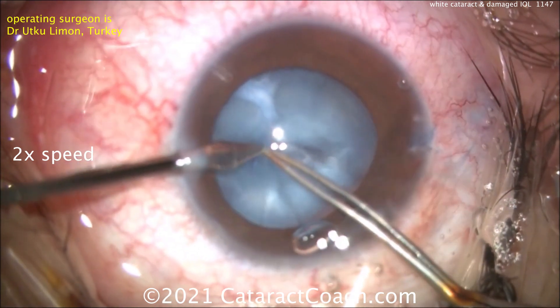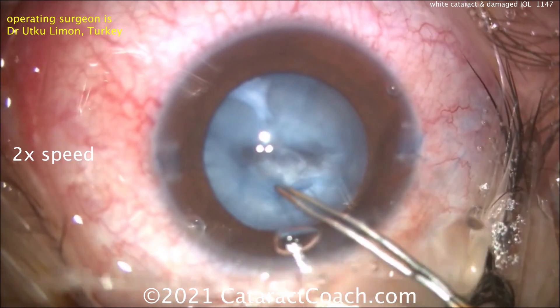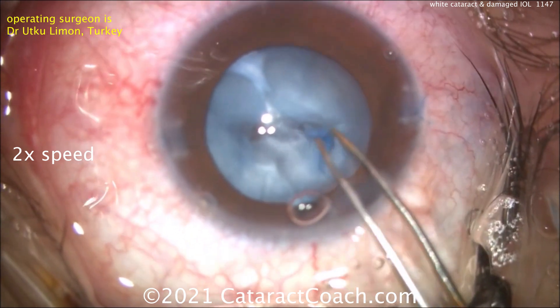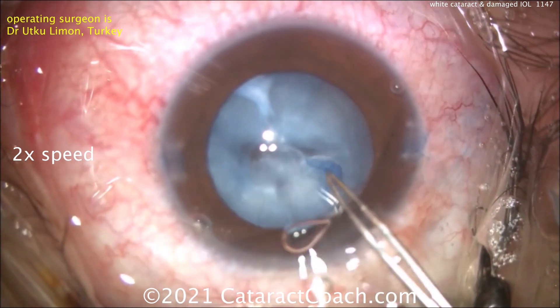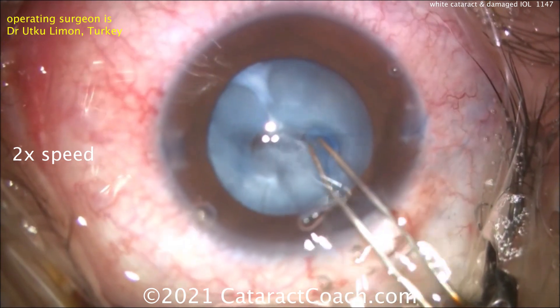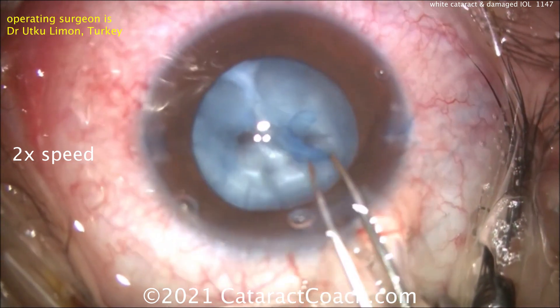Here's something innovative — using an MVR-style blade from the paracentesis to help nick and cut that capsule to continue and get the rhexis going. And here we go, very nice, keeping it going around. You can tell that at the opposite end, that other fibrotic area of the capsule will probably pose the same issue, so moving it around and getting the rhexis going.